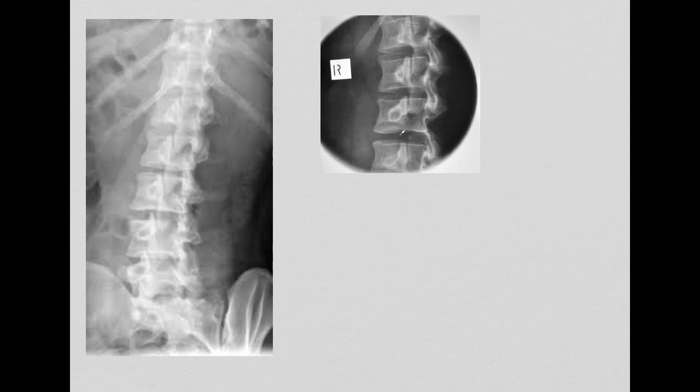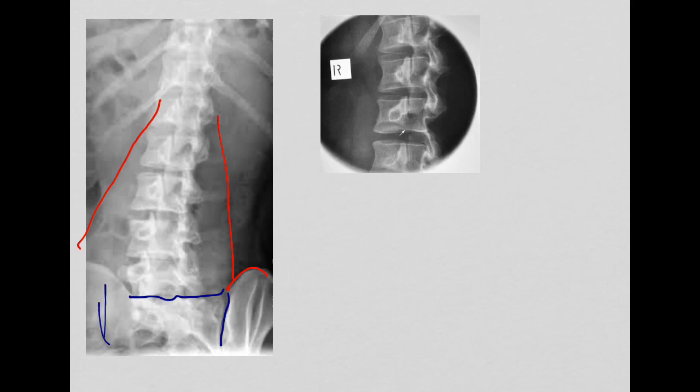Other structures that you might see on an oblique would of course be the shadow of the psoas here and here, our iliac joints, our SI joints — this one's open, this one is closed — the base of the sacrum, and last but not least, our intervertebral disc spaces.